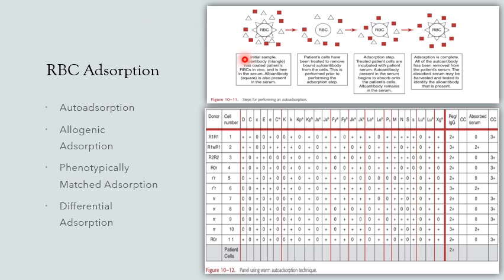For the procedure, first wash thoroughly the autologous RBCs to remove unbound antibodies. In this figure, yung autoantibody natin is yung triangle and the alloantibody is the square ones. Next step is to treat RBCs to remove autoantibodies coating the RBC.